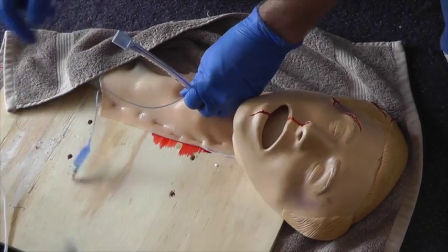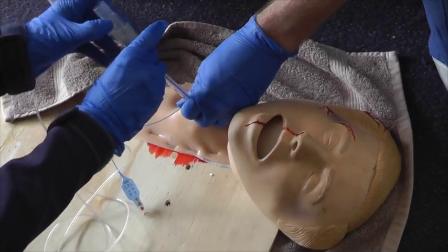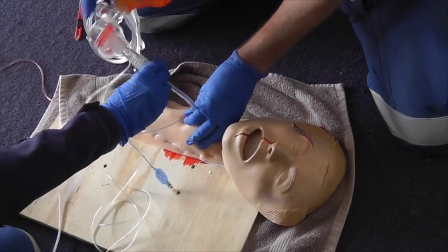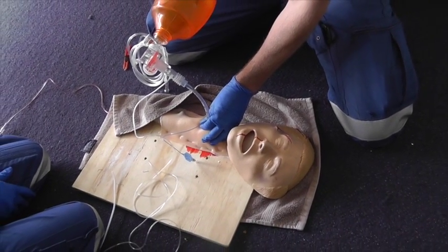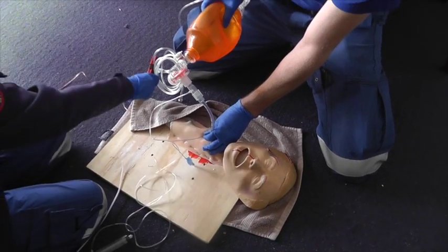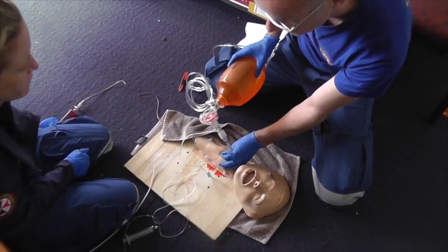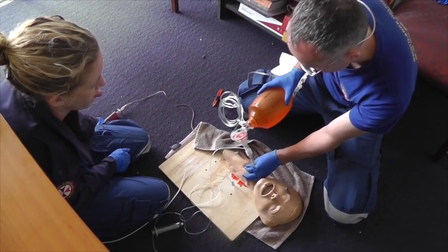Connect the end-tidal CO2, please. The bag is connected to oxygen. I'm stabilizing this tube, squeezing, looking at end-tidal CO2. Can you listen to both sides of the chest to exclude a right main bronchus intubation? Good end-tidal saturation is maintained — that's a successful airway.